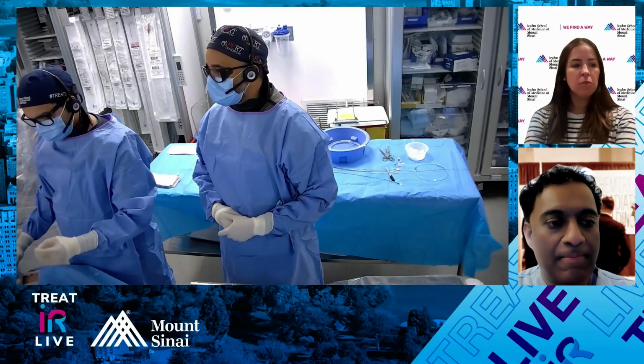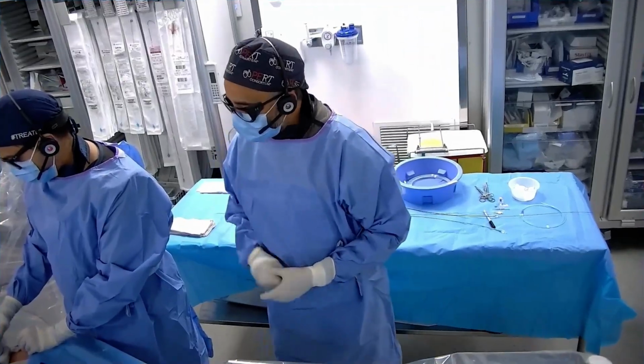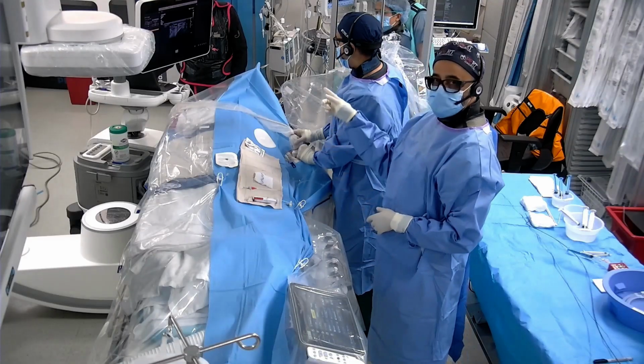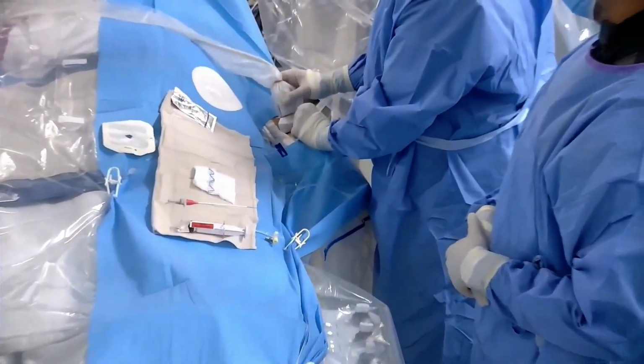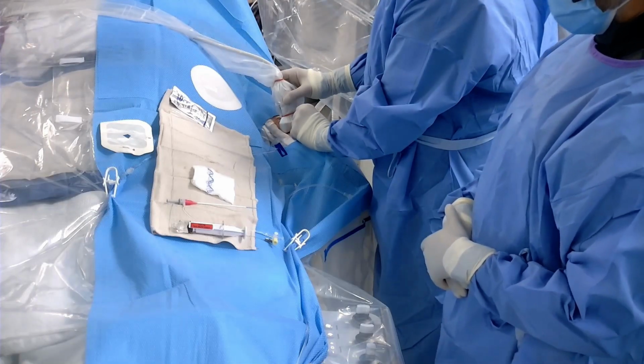And Rahul, let's talk a little bit about your choice of access. Yeah, so Ishan right now is getting radial access. So we numb. He's going to use the needle to get in. I don't know if you guys can see the ultrasound. So he has a nice big radial artery. He's had that right groin accessed a couple times. He's going to get it accessed one more time to get the limb extension placed later. So we figured we'll just stay out of it for now.